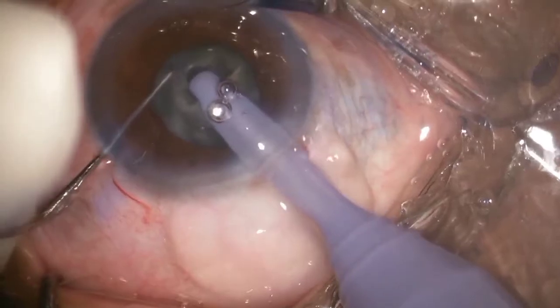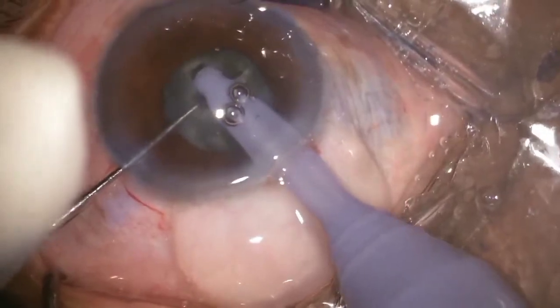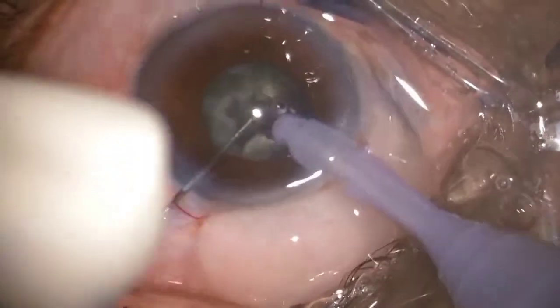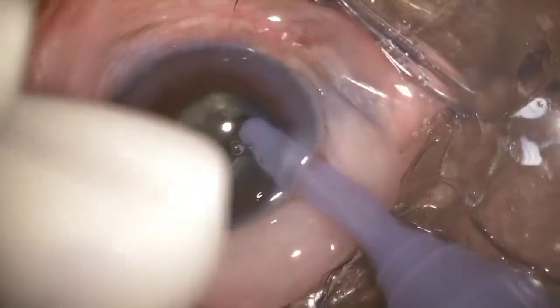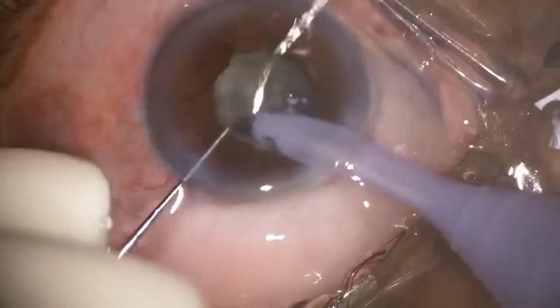But it's a hard cataract, so it became impossible for me to crack the nucleus. So I again started doing the plus sign. But as I noticed, the pupil size became smaller and smaller, and the plus sign I made was also very small, and it was really impossible for me to crack the nucleus. The more I manipulated, I was getting fearful that it may injure the zonules or cause a PC rupture.